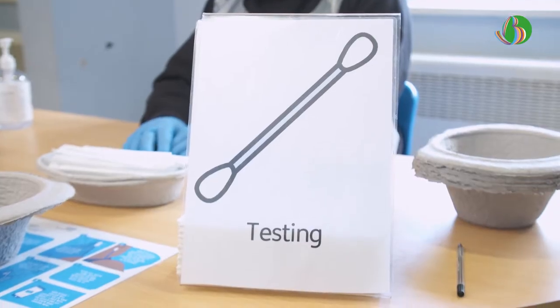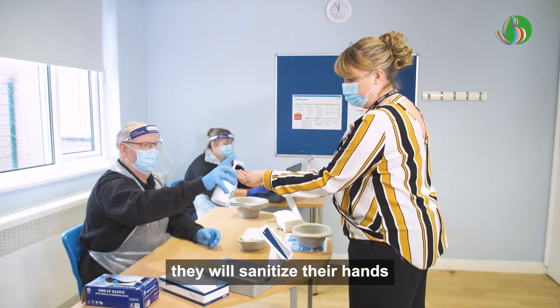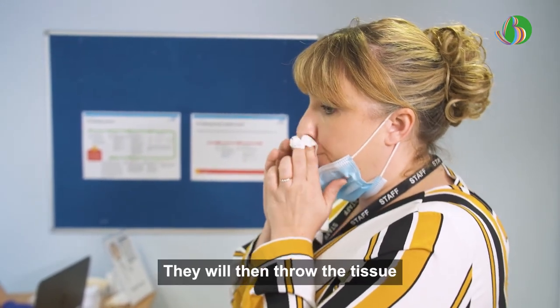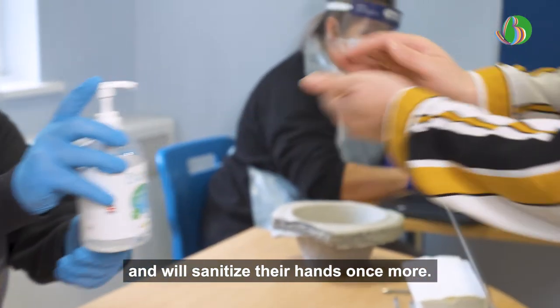Testing. They will then step up to the swabbing desk, sanitise their hands, and blow their nose into a tissue. This gets rid of excess mucus. They will then throw the tissue into the clinical waste bin and sanitise their hands once more.